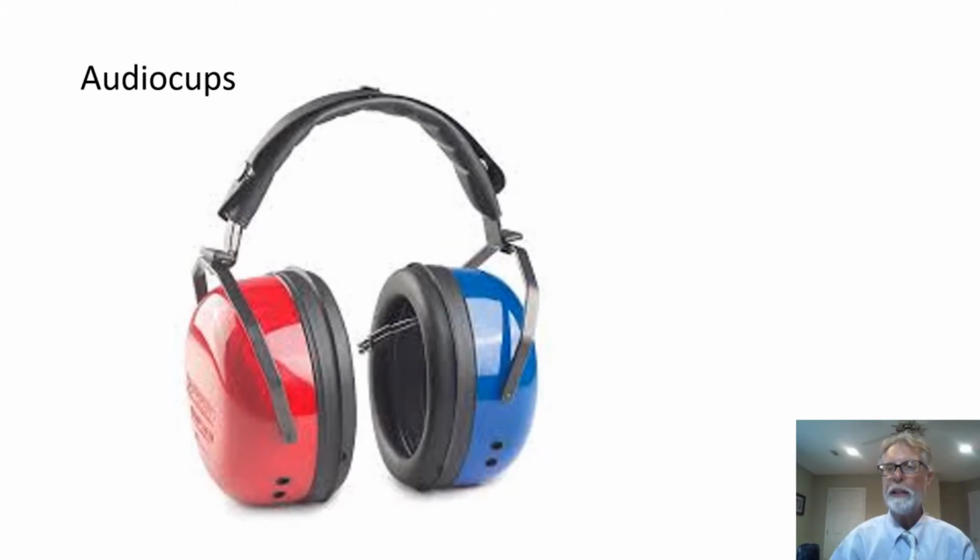You have to be testing in a very quiet room, a very quiet place. And so someone doing testing would want to set their audiometer up in a place that is typically quiet. If there is no such place, and you don't have a sound room or a sound booth made specifically for hearing testing, you have to get the quietest place possible.